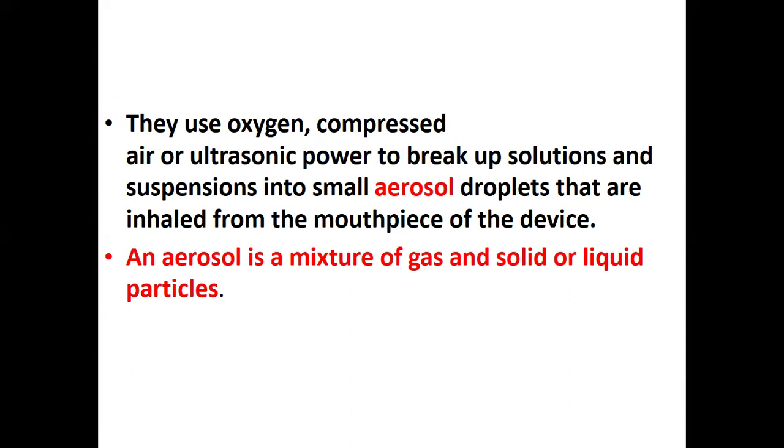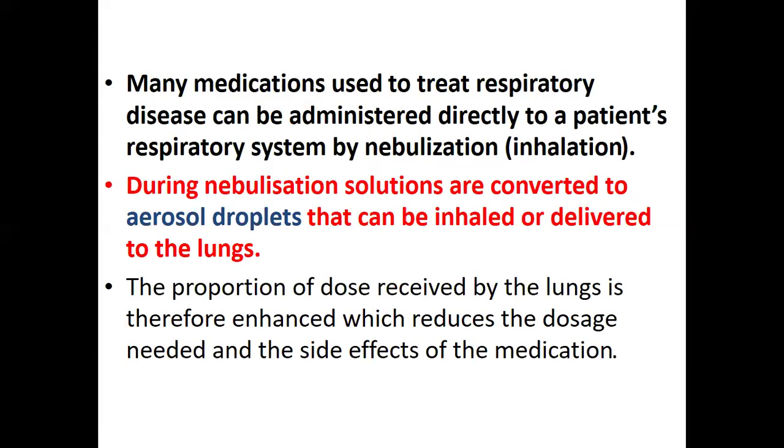When you press perfume, you see some small droplets coming out, in the form of mist. Those are what I refer to as aerosol droplets. Those are coming from a suspension or a solution. So this is what happens in nebulization. A nebulizer will break down the solution and suspension and make it into small aerosol droplets that can be powered out.